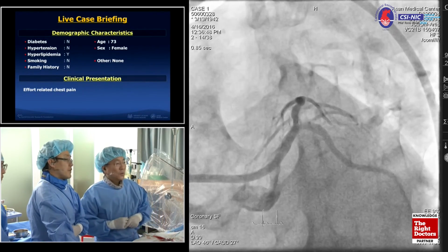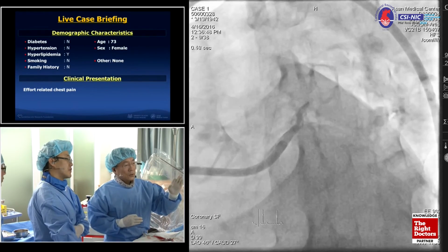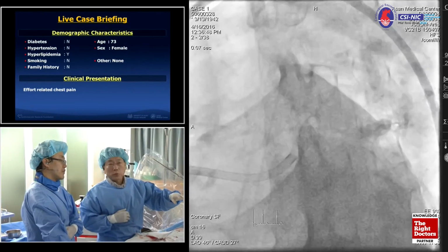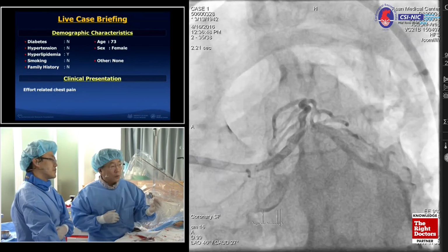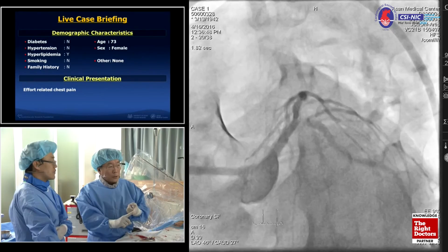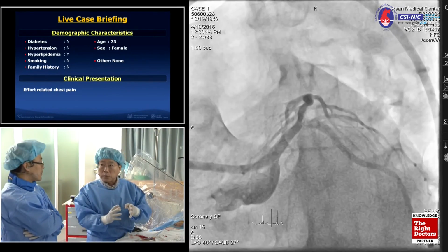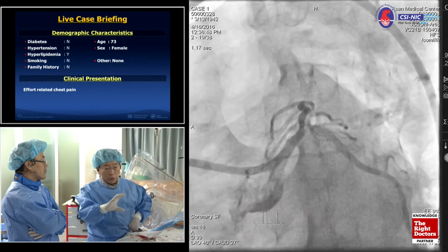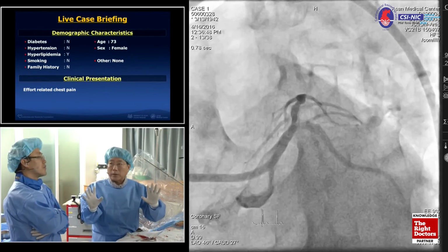Right. So actually, we are gonna do IVUS evaluation in both branches. However, before that, based on the angiographic findings, it's mainly ostial circumflex disease, and so we have some options. Balloon angioplasty and just drug-eluting balloon for the discrete narrowing of the circumflex ostium, or another stent for the circumflex ostium. Whatever you choose, the TAP technique or culotte technique, I think it doesn't mean anything, right?